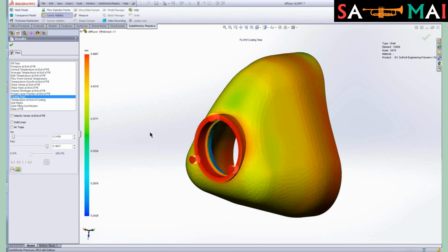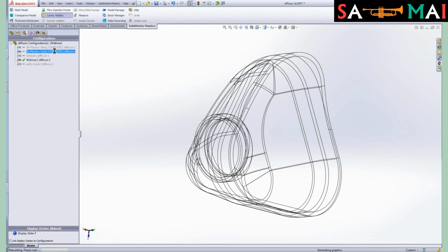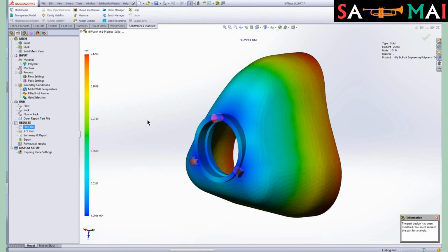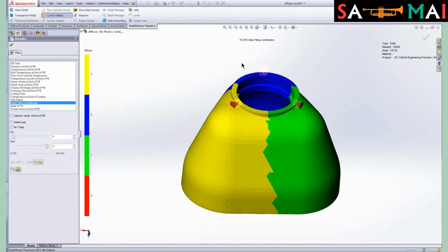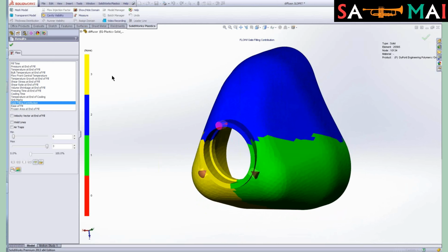All right, so let me switch to one last configuration here. We'll go to the solid completed model. And I'm going to read in the flow results just to show you that if you use a solid mesh, you get a more balanced gate filling contribution, if you will, using solid elements.